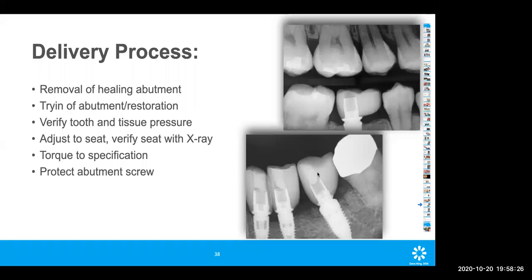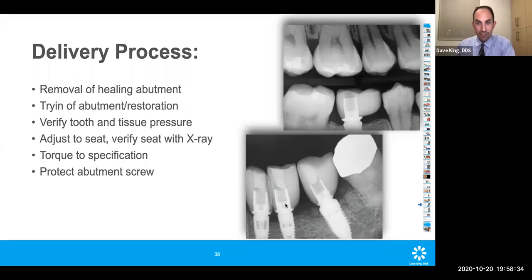Great. And how did you manage to place screw retained on tooth number 20, with that severe angulation? Talking about these guys over here. So the nice thing about it, when these go together, it's a conical connection. The draw path allows for some play.